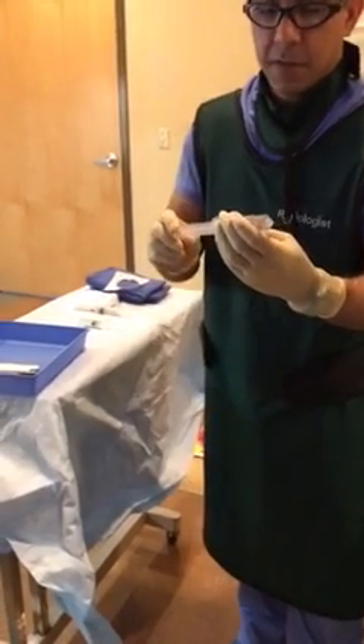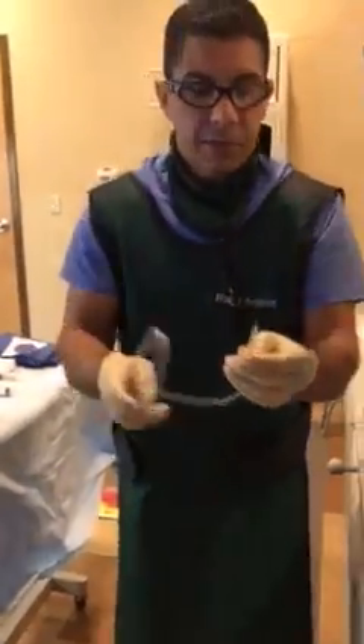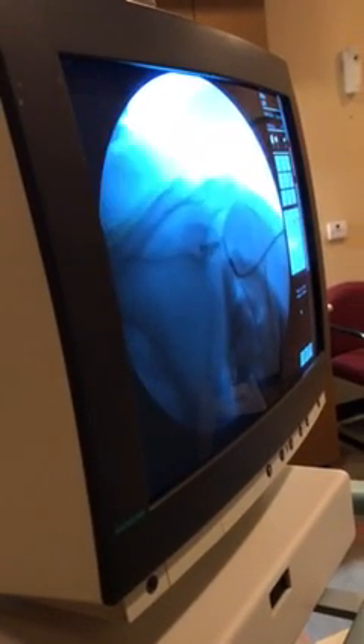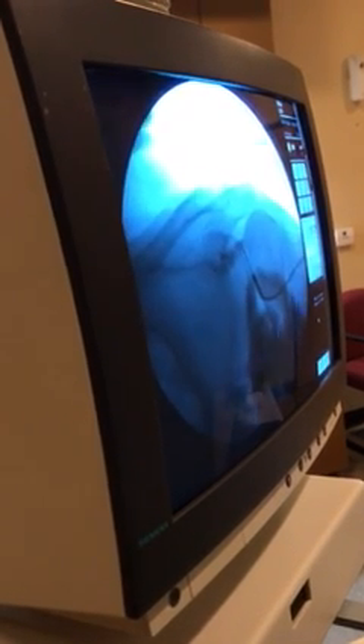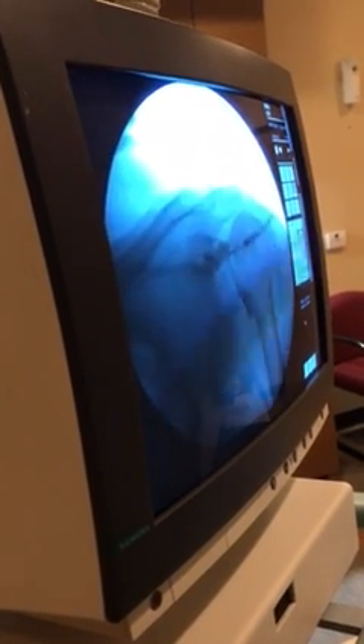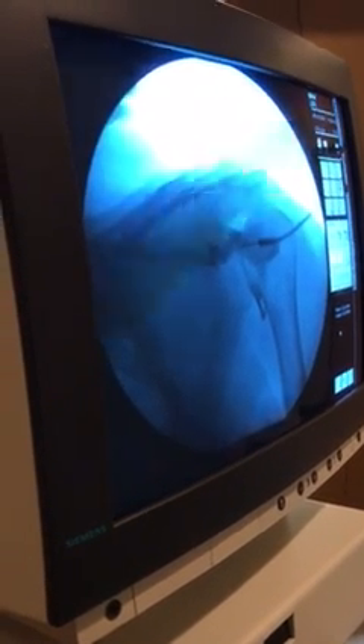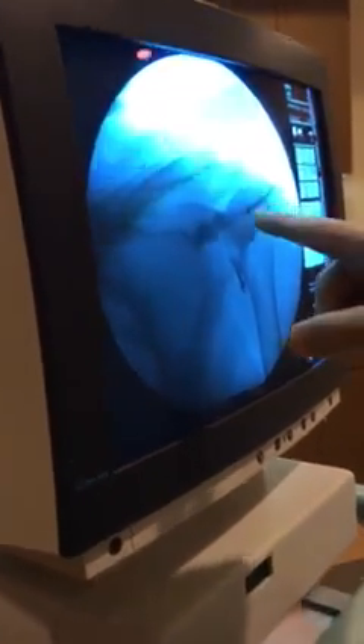You can take some CT contrast mixed with a little bit of saline and use that to test if you're in the joint space. Put that onto your needle. A lot of times you'll hit the humeral head, you'll feel that resistance, and that's good. Now that I've put the needle there and hit the humeral head, I start injecting contrast — you can see that the contrast immediately moves away from where I put the needle and starts filling the joint space. You can tell you're in the joint space because there will be a little recess here, the subscapularis recess, and you'll see some contrast down in the axillary pouch and even overlying the humeral head.